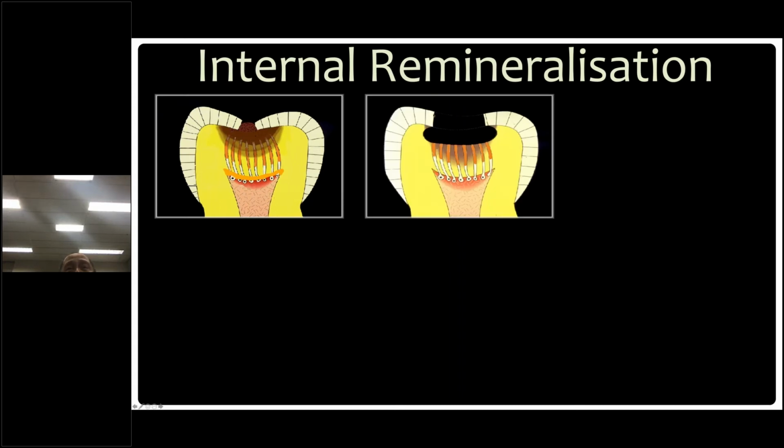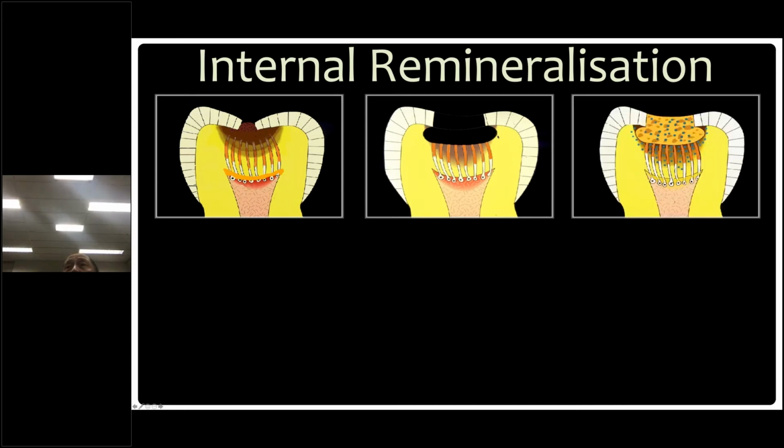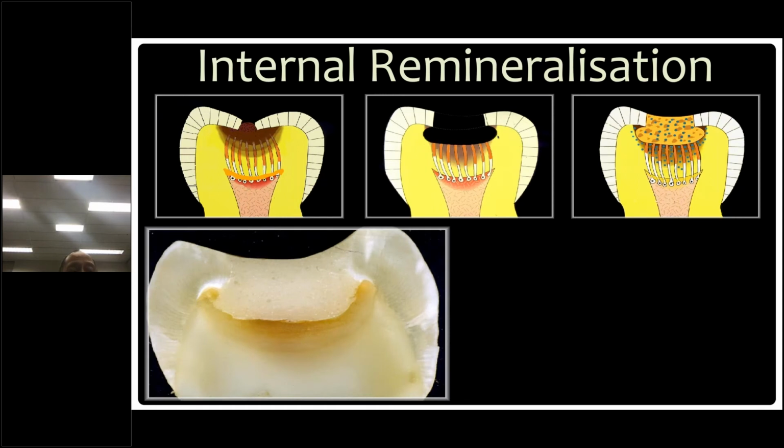We basically just have a clean enamel margin. They're all class 1. We didn't even use a burr here. We clean nice and tight, make sure that you actually have a clean border. We put glass ionomer cement in, and this is one of those teeth. When they got extracted, they were sent to me for processing.